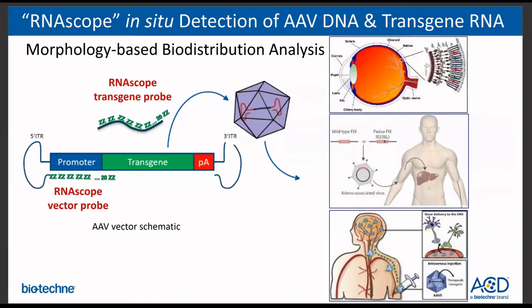So yeah, we use the AAV transduced detection in human liver, as you can see in the middle panel, and then we can also detect the AAV transduced signal in human brain, as well as some NHP brains, etc.